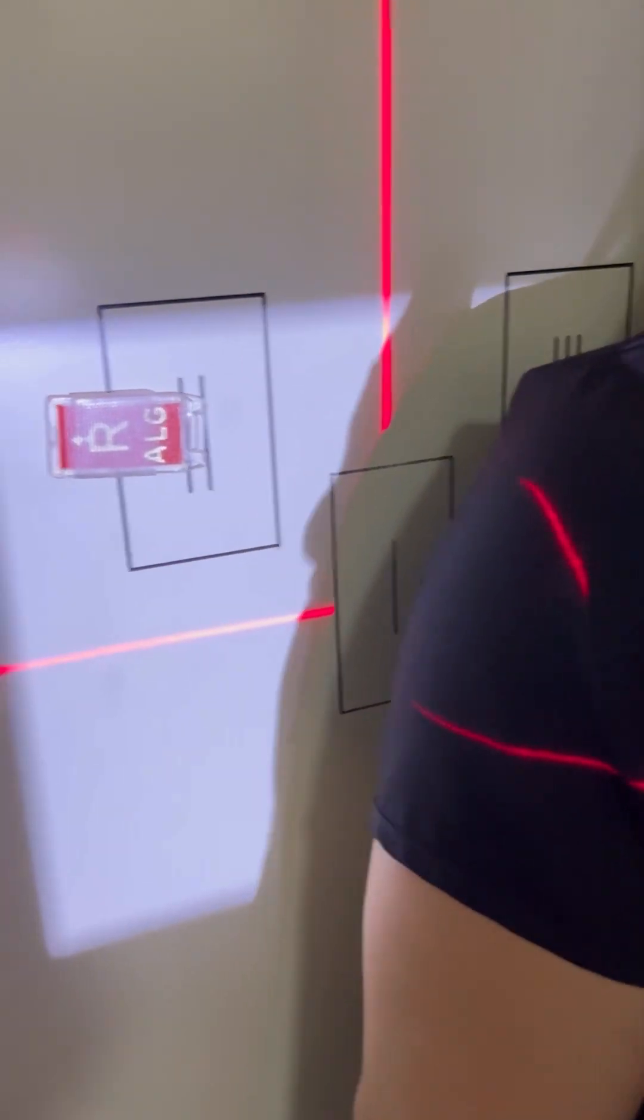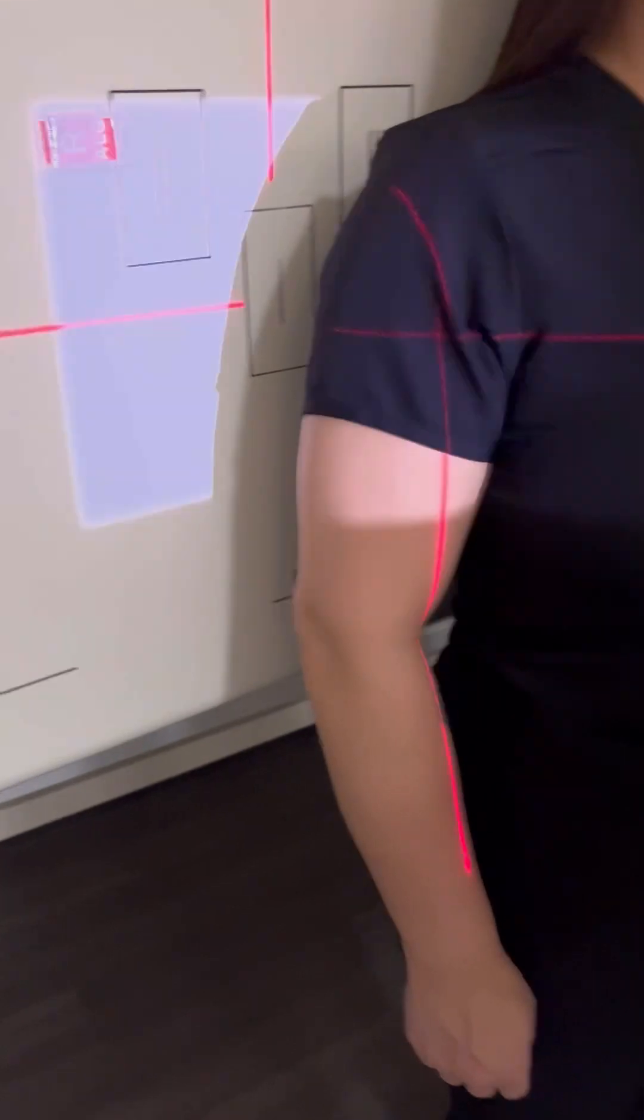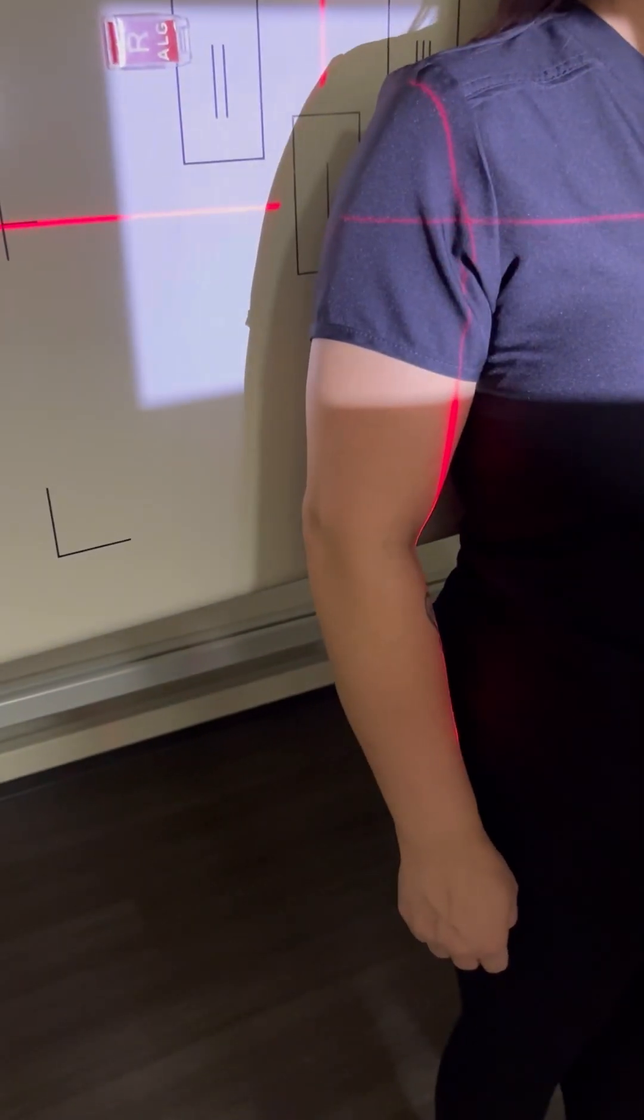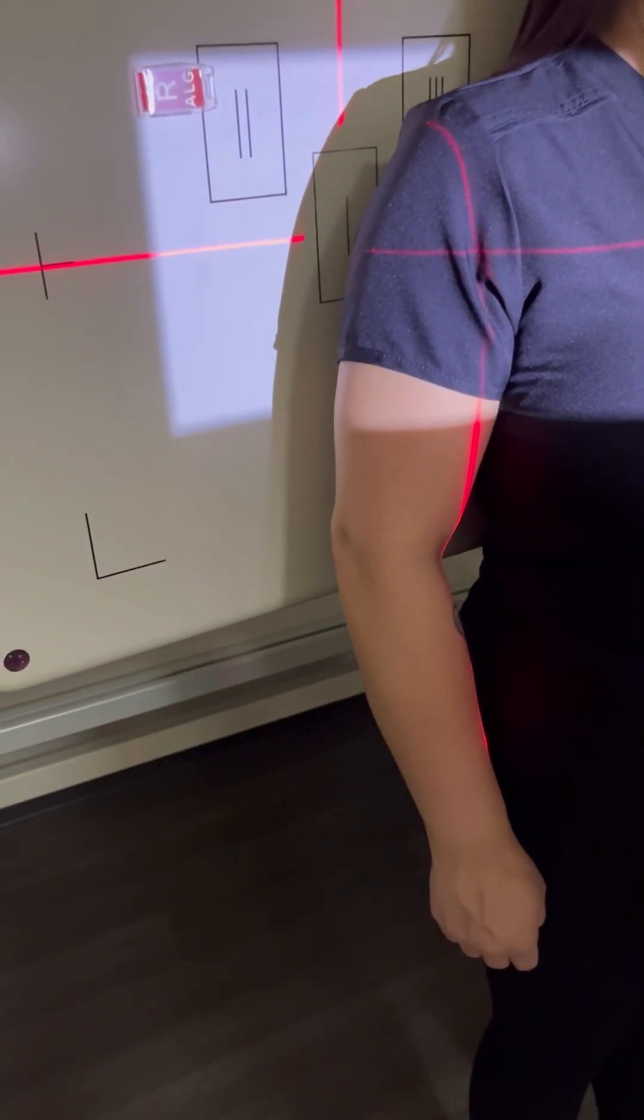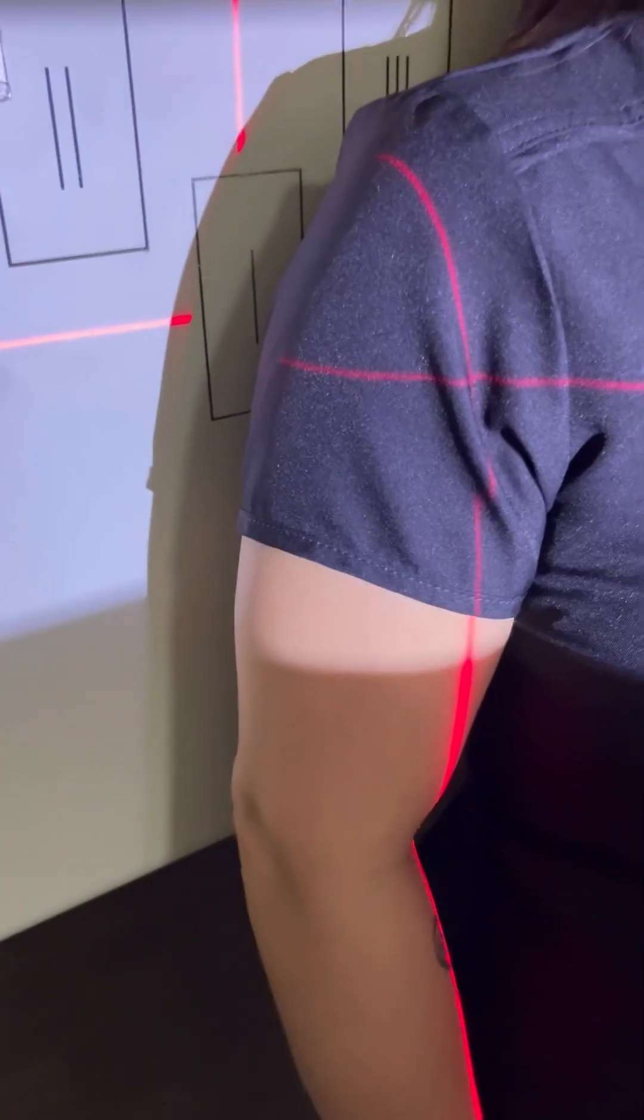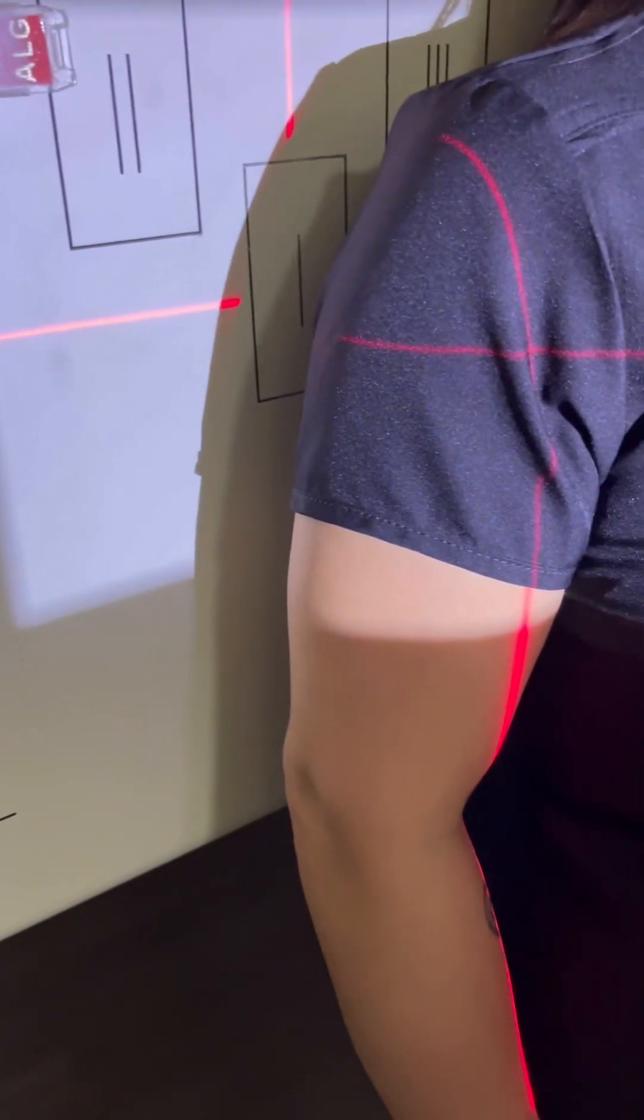Different sites want you to include different things. Certain ones want you to get the entire clavicle and the entire scapula, and some only really want you to do the shoulder joint and kind of cut the other part off, but I'm just going to show you getting the entire thing.